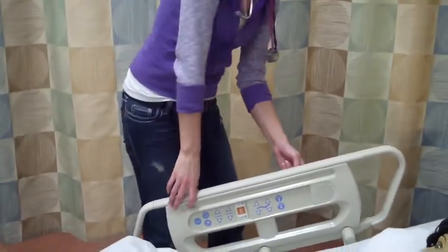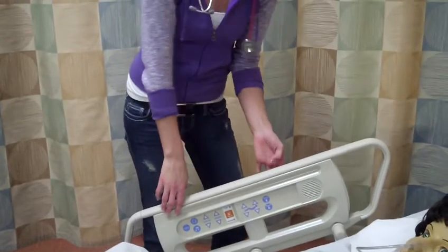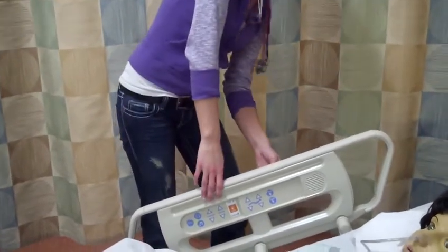raise her head of the bed, and raise the actual bed right up.